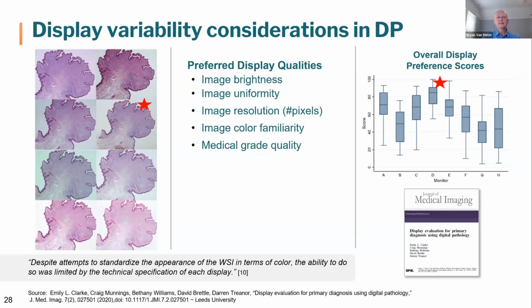And they had those displays, they were all calibrated the same way. They brought in IT experts. They brought in calibration software and paraphernalia and tools. And they made sure that the displays were in the same environment. The image management system had the exact same factors on it. And they even took these pictures at the exact same distance from the screen. And you can see what happened. None of them looked the same.